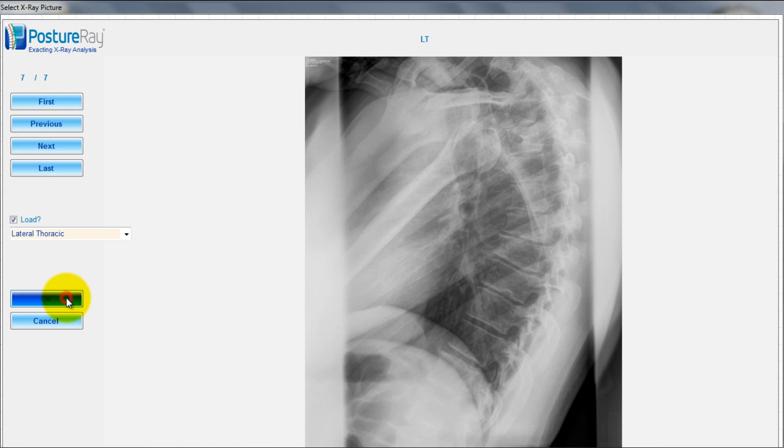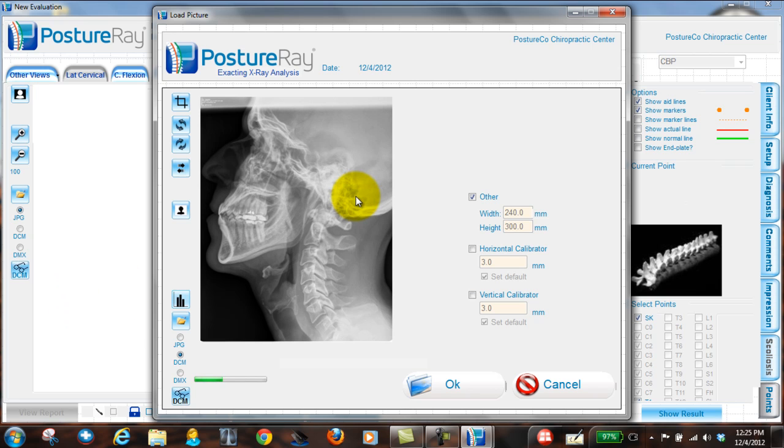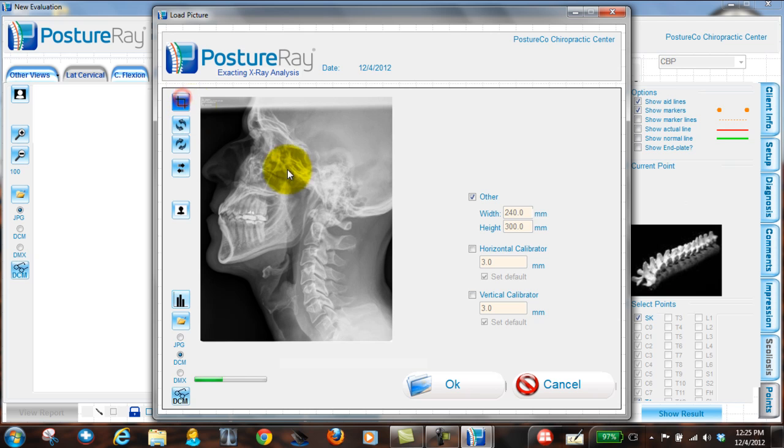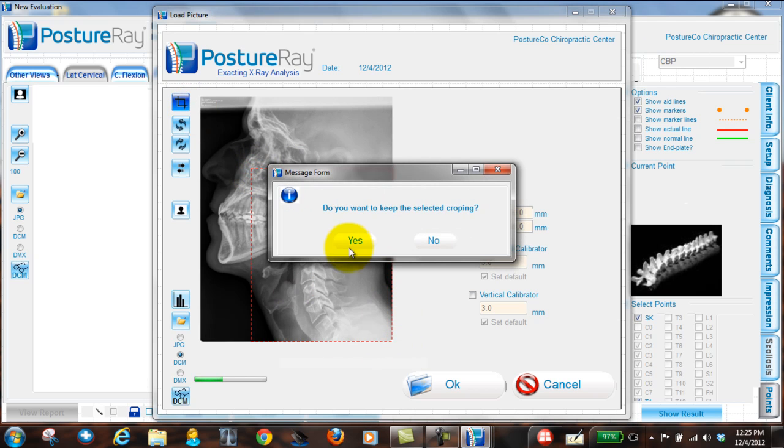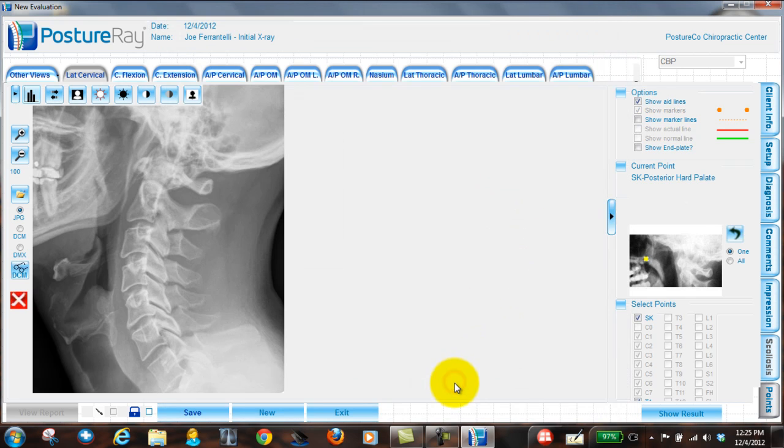Now at this point, what you want to pay attention to when we pull images in, if you're using your own X-ray server, this probably won't be an issue. But if you're getting images from an outside source, pay attention that one of the ways we can make sure that this is accurate is we can calibrate using the DICOM format. We have known parameters inside that image file. So I know the true dimensions of the film right here. You see that? So I can at this point, if I'd like to, I'm going to crop this down a bit to make it kind of look like an eight by ten.